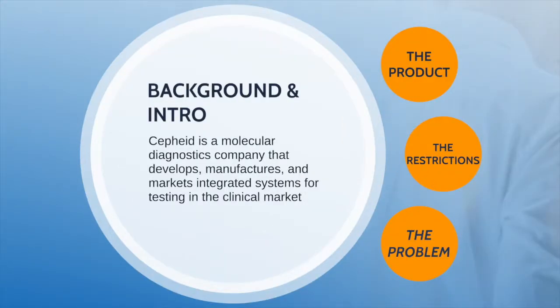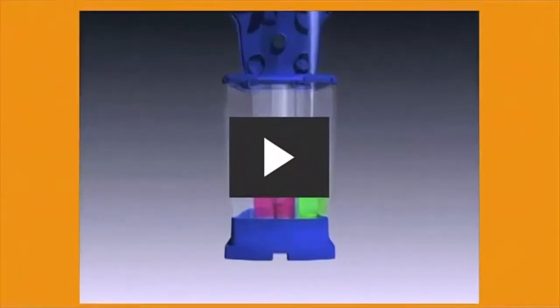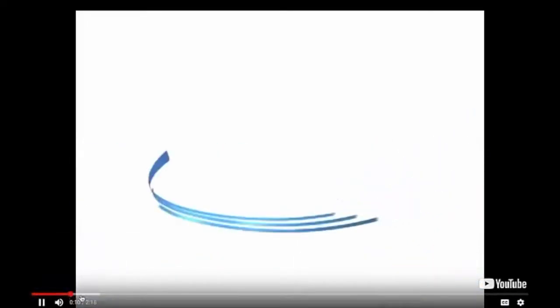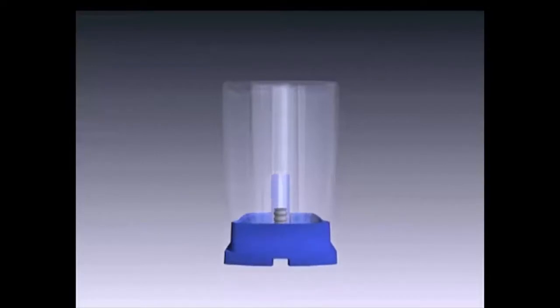Cepheid is a molecular diagnostics company that develops, manufactures, and markets integrated systems for testing in the clinical market. Their main product is the GeneXpert cartridge. As shown in the video, the plastic cartridge is made of several components, such as the base, the body, multiple valves, and the lid. With this product, medical professionals administer tests that check for approximately 30 different conditions.